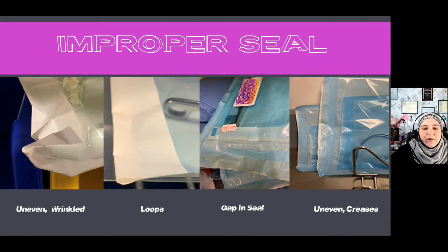And then you have uneven creases in the seal. You've got these wrinkles and creases going through your seal. Those are just channels for those little microorganisms to be like, oh, yay, thank you so much, and run into the package. So you really want to make sure that you have a nice flat, even seal regardless of what type of pouch you're using.